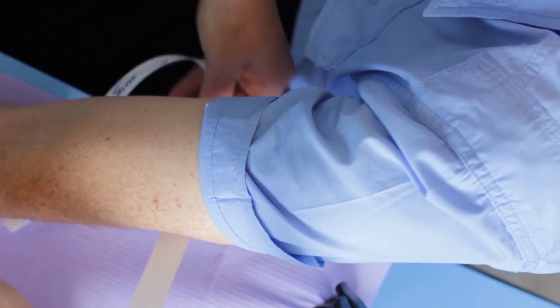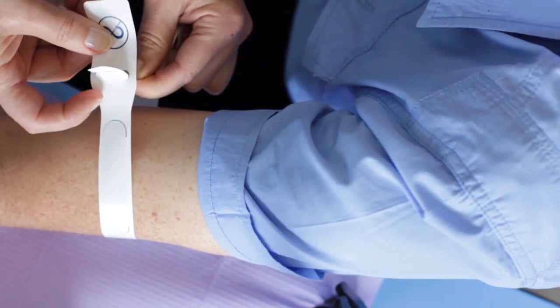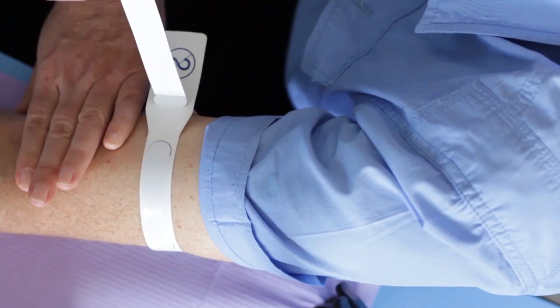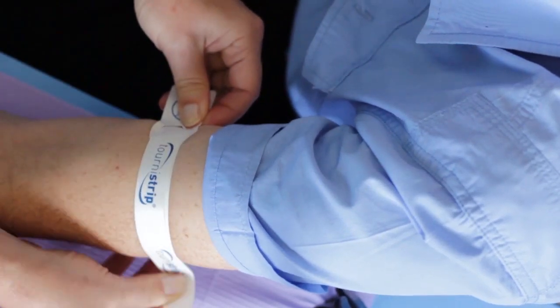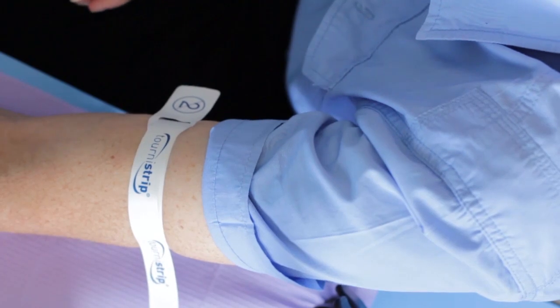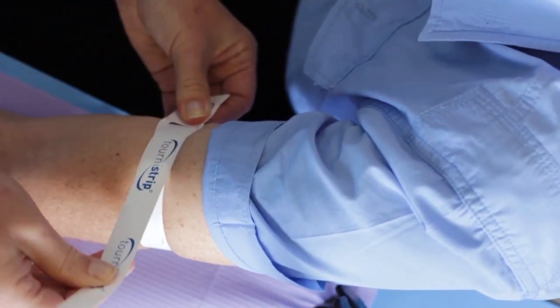Place the tourniquet strip around the arm with the printing facing out. Slip the slim end through the slot and the tab end. Hold the tab end between thumb and forefinger and pull the other end to tighten. When tension is sufficient, bring the long end down onto the exposed adhesive strip. If necessary, lift the tourniquet strip away from the adhesive and reapply.